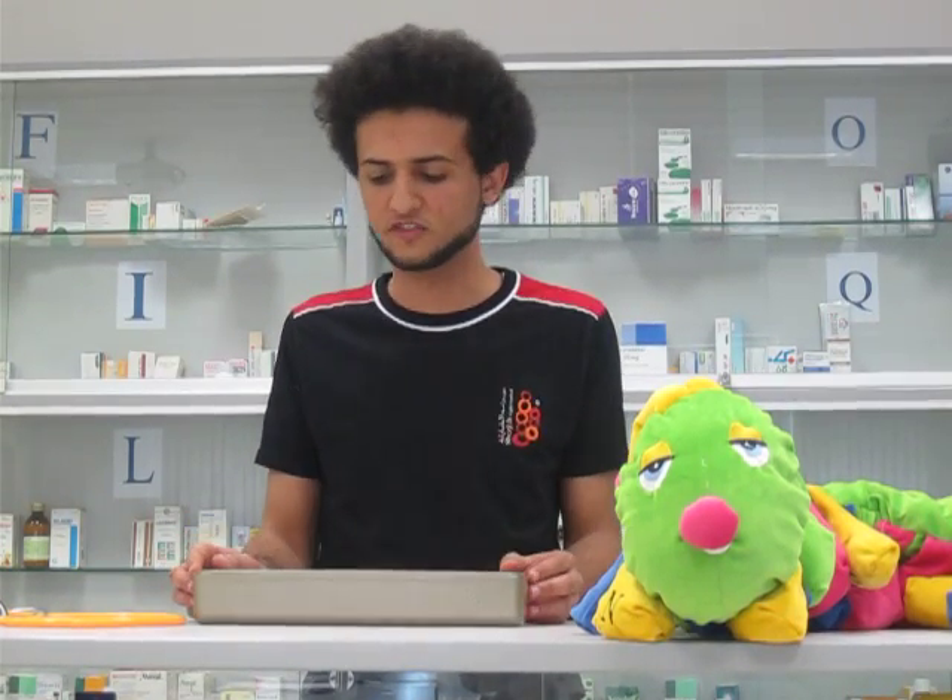Bonjour, this is your Dr. Patrick. Welcome to Champs-Élysées Pharmacy. I'm here to show you how to use the sphygmomanometer to measure your blood pressure.